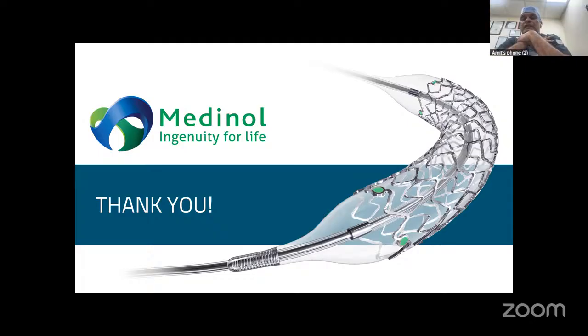I feel it is an excellent stent, particularly looking at that nitinol that is on the top of the balloon. Trackability should really be good, and I have not used it until now, but it will be good to use this stent and see how it goes.